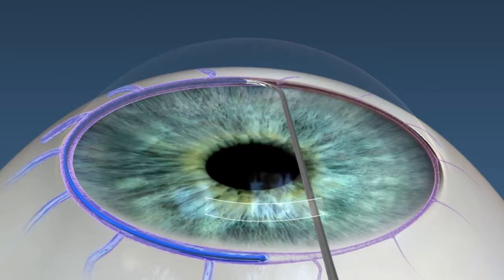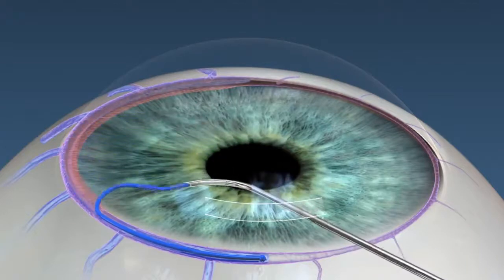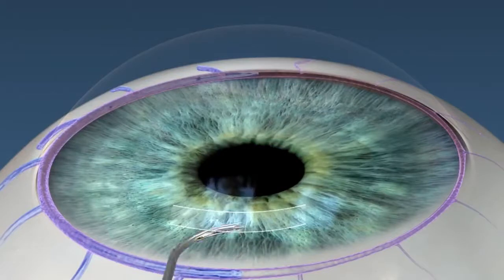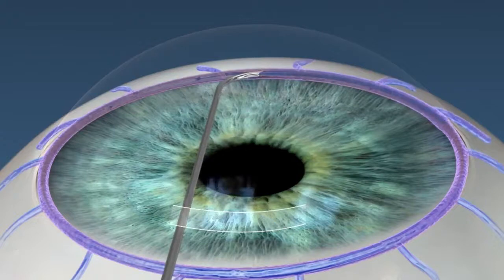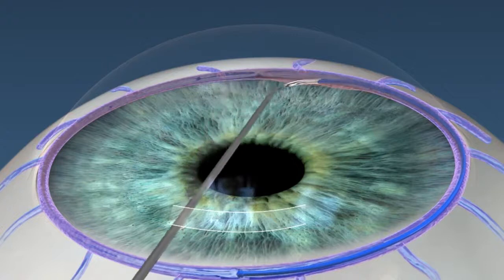You can also use the catheter to unroof the trabecular meshwork, where there are some additional points of resistance. The beauty of this device is you can titrate how aggressive you want to be — you can do 360 degrees of dilating Schlemm's canal or you could do 180 degrees. It really helps you determine how aggressive you want to be based on whether your patient is mild or moderate, and how much pressure reduction you want to achieve.